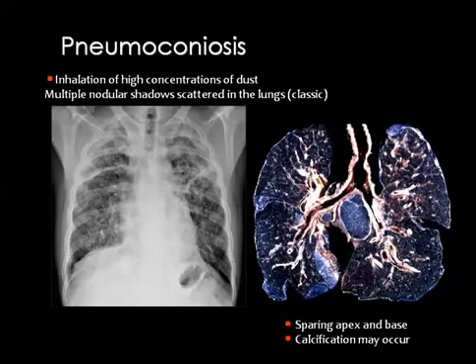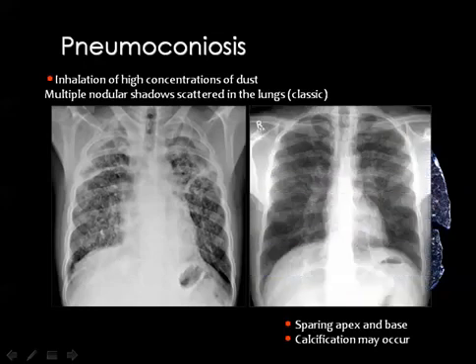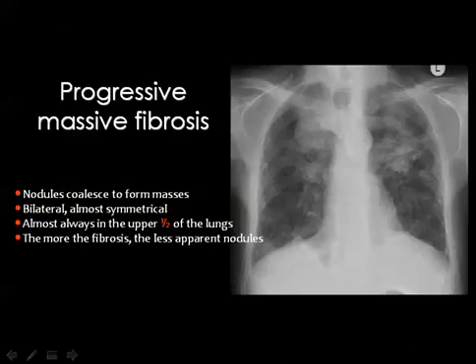And pneumoconiosis means that you are dealing with opacities in the lung secondary to working in industrial projects, for example, and you have the miliary shadows in the lung, which are very dense because of the composition of the nodules. You can compare the density of miliary TB nodules with the density of pneumoconiosis nodules. Nodules of pneumoconiosis are very dense, and nodules of the miliary TB are usually soft.